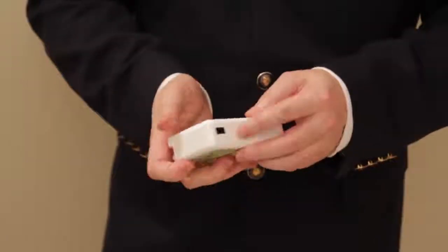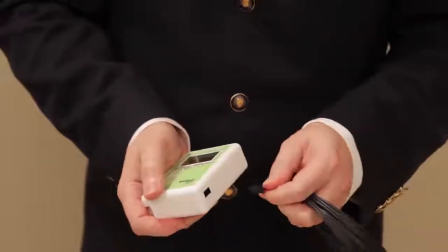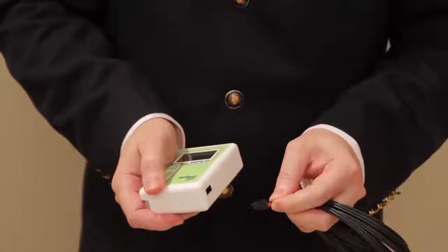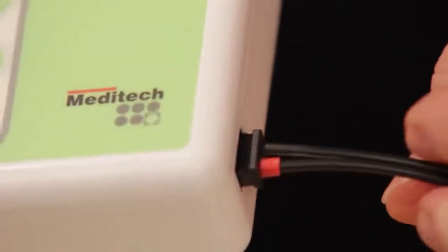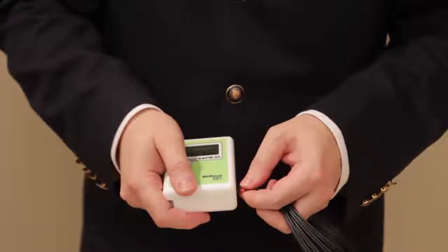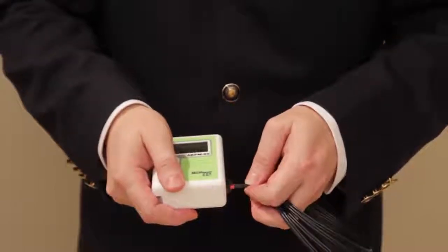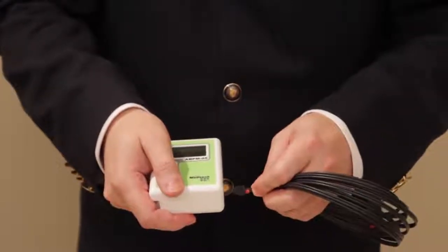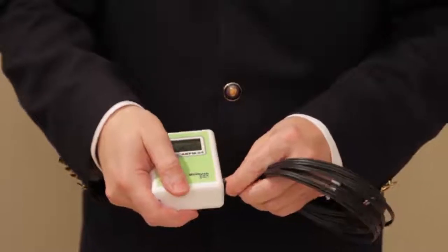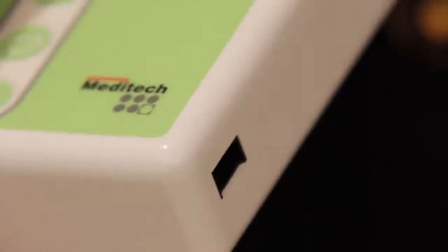To connect the device to the computer, just take the end of the cable with the red marker to the edge of the device and push it in until click. To disconnect the computer cable, do not pull on the cable itself. Grab the plug and pull. So to connect it with red down, just push until click. To disconnect, pull on the plug.